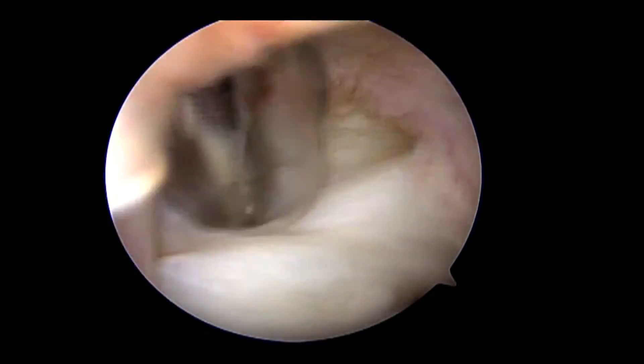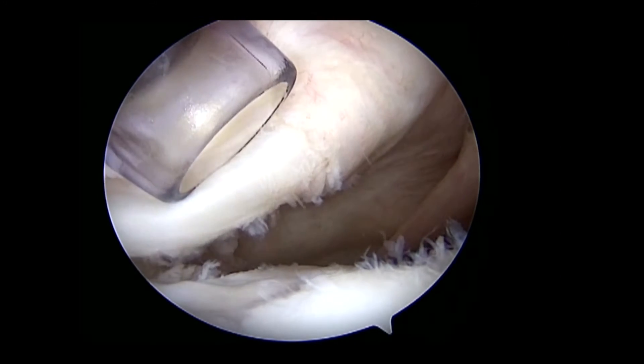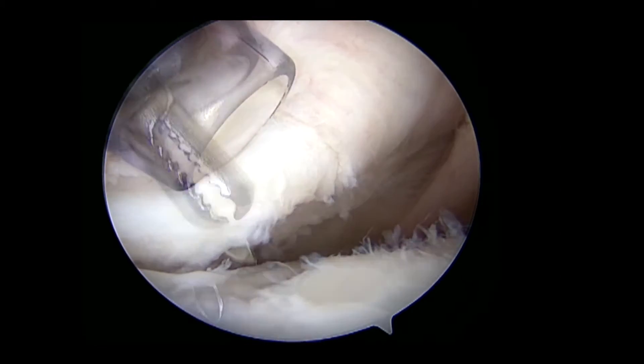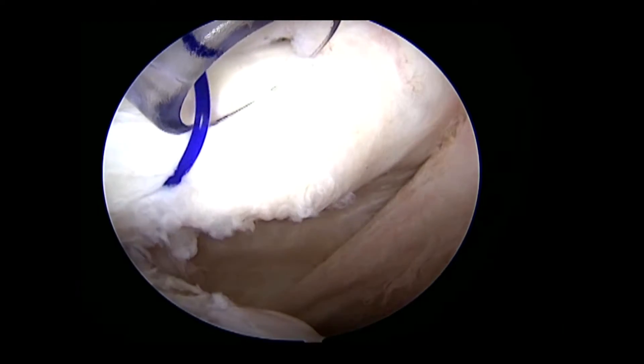Subcoracoid debridement is performed with attention paid toward clearing the space anterior to the subscapularis tendon to facilitate future suture retrieval. A spinal needle is inserted percutaneously through the subscapularis tendon at the level of the reverse Hill-Sax lesion and a PDS suture is passed and retrieved through the cannula in the anterior inferior portal.